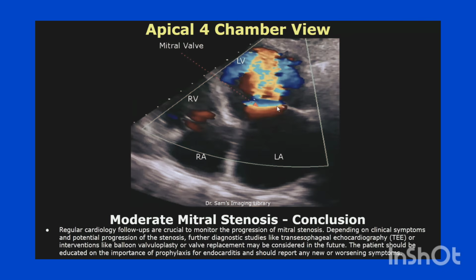Regular cardiology follow-ups are crucial to monitor the progression of mitral stenosis. Depending on clinical symptoms and potential progression of the stenosis, further diagnostic studies like transesophageal echocardiography or interventions like balloon valvuloplasty or valve replacement may be considered in the future.